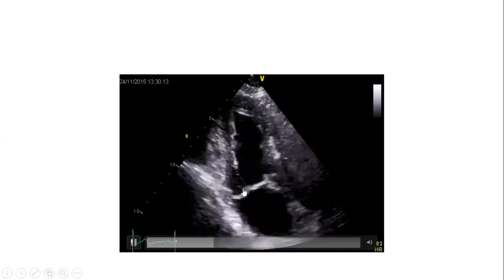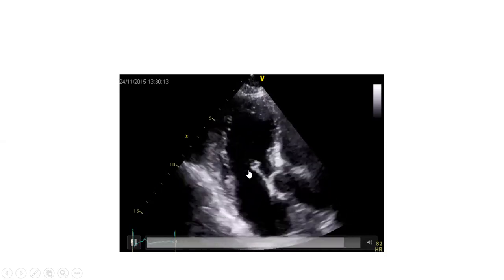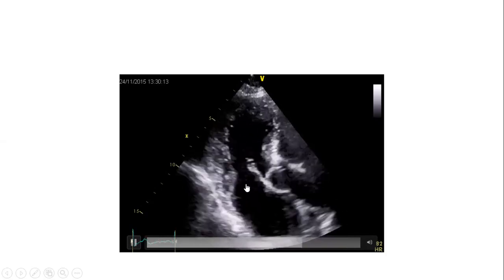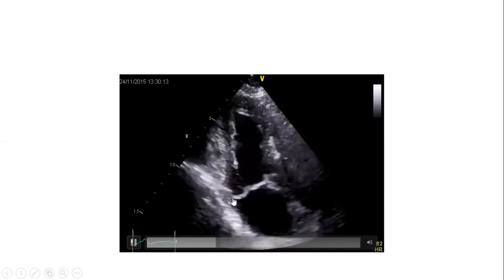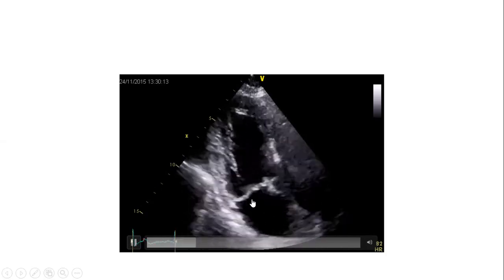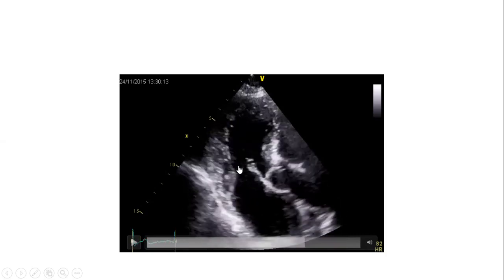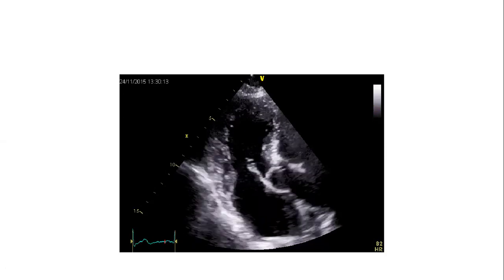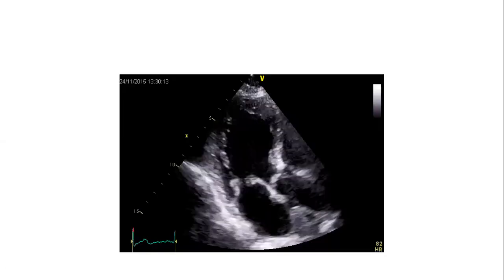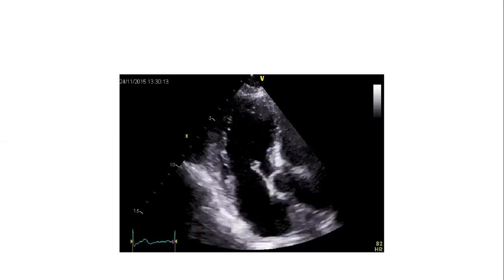The mitral valve is getting pushed into the LA. Look very carefully, as if it's trying to close, the septal AML and PML, the leaflet's body, is getting pushed into the LA. If you switch on color flow mapping, you will find significant MR in this patient. Is this flail or prolapse? This is not flail, not prolapse. Neither flail nor prolapse. Okay.